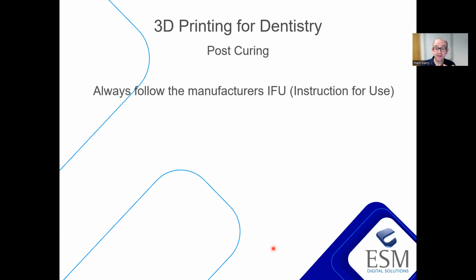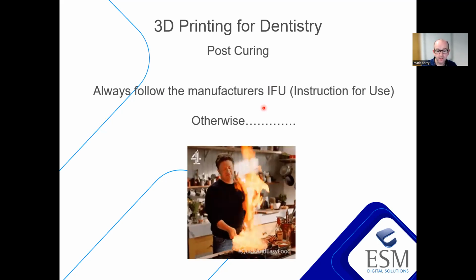I even saw a guy, he got a little plastic box, put a connector in, and decided that was his nitrogen chamber. He's going to hook a nitrogen supply up to it. And it's just worryingly crazy, exciting and interesting, but not if it's something that's going to go into the patient's mouth. So always, always, always follow the manufacturer's instructions for use. Otherwise, you're playing with fire.